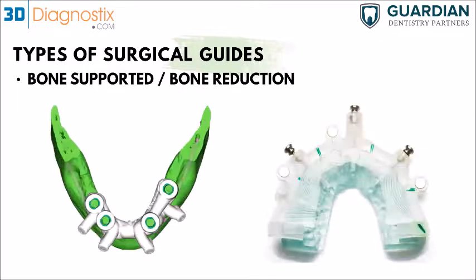And finally, this is the bone supported guide. So we've got two types of bone supported. We've got the conventional bone supported guide on the left side right here. So this would have an intaglio that would seat or rest on the alveolar crest, and then also fixation pins on the buccal so you can fixate it in.